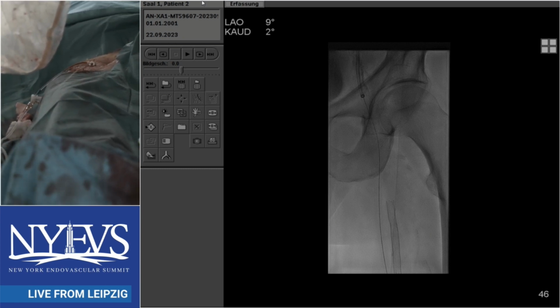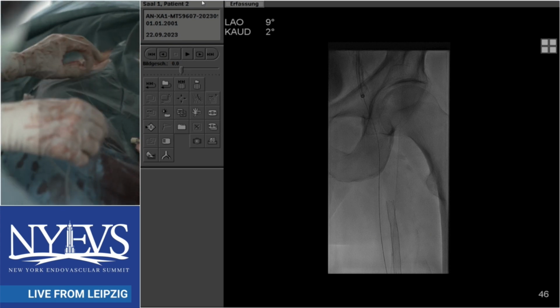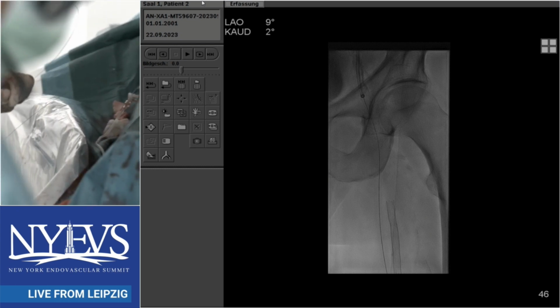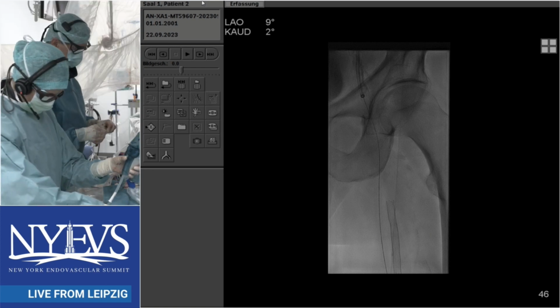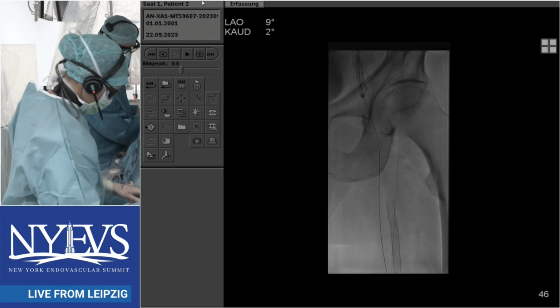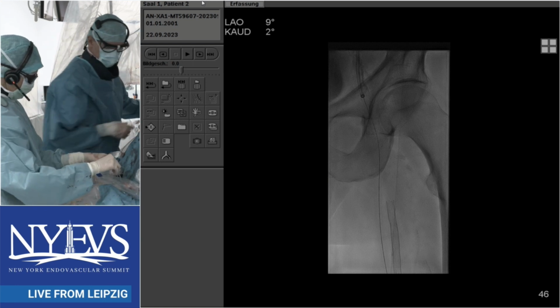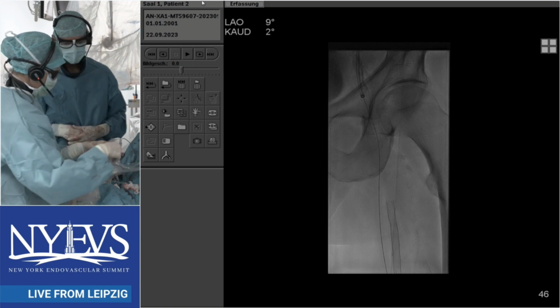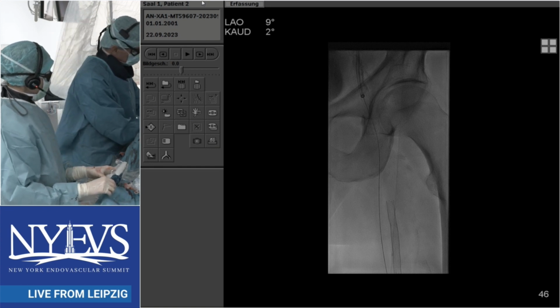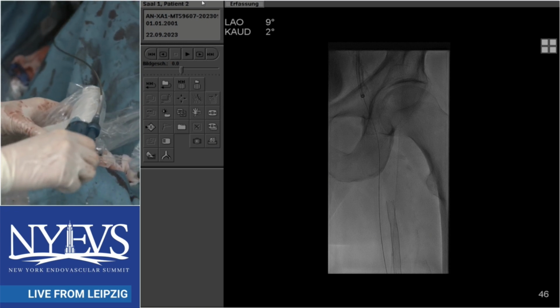So your plan now is to do Rotarex and then see where you are at that point, right? In terms of delivering a definitive therapy after. Yeah, so potentially it needs some reconstruction with stents at the distal anastomosis. Andre, as you're doing this, which is a great tour de force, what are your thoughts on how to improve the success of this bypass that you're about to fix? Because I think we're going to deal with the same problem in terms of the short-term patency probably, but do you have any thoughts as to your steps once you debulk it and what your treatment plan is?